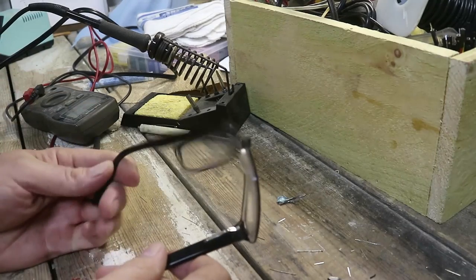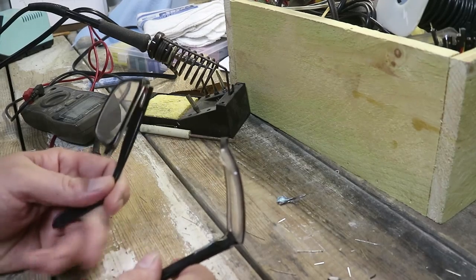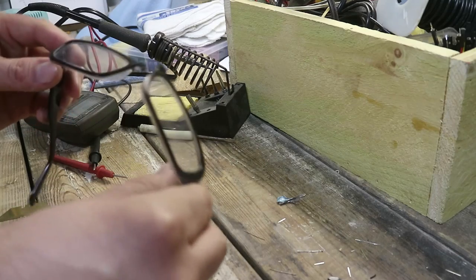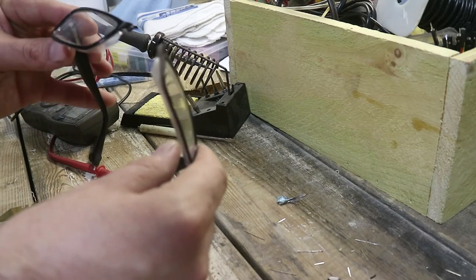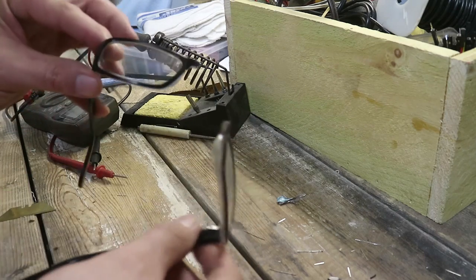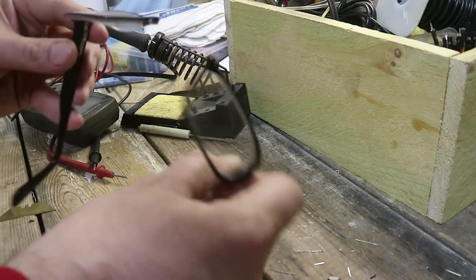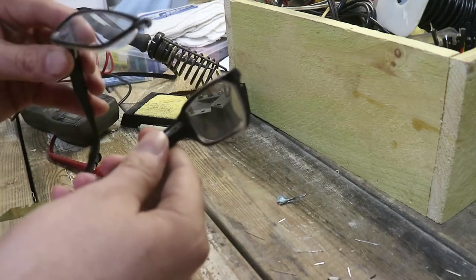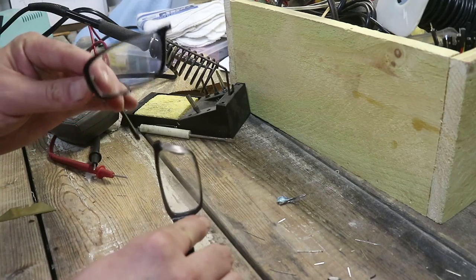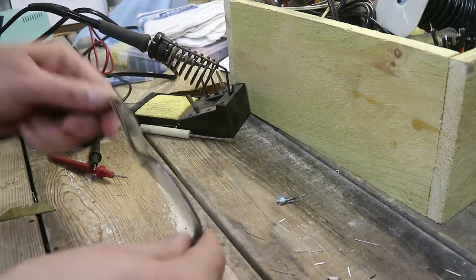I wanted to record a video today, but I really didn't have anything to make, or the motivation, until this happened. This is my only pair of glasses, and these are like the $19 plastic frames from Walmart, so they're not special, but they're my only pair. And I don't have my prescription, so I can't just go order a pair off of Glasses USA or whatever right now, so I'm gonna have to repair these.